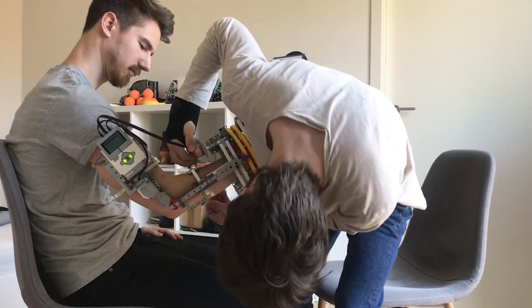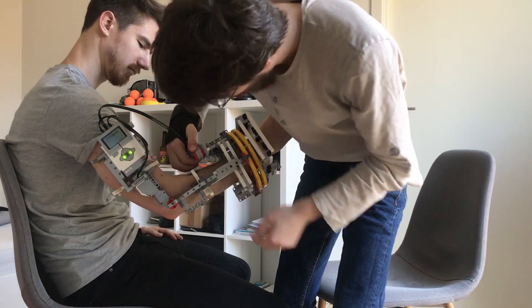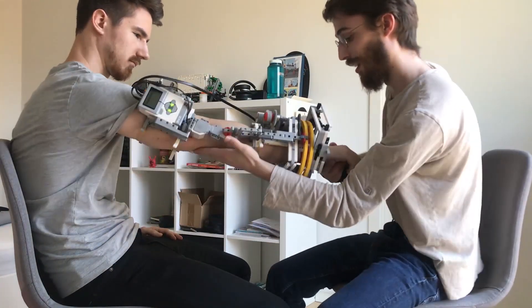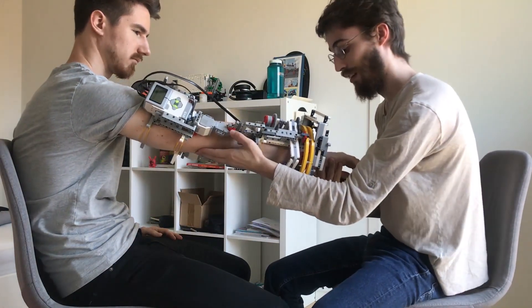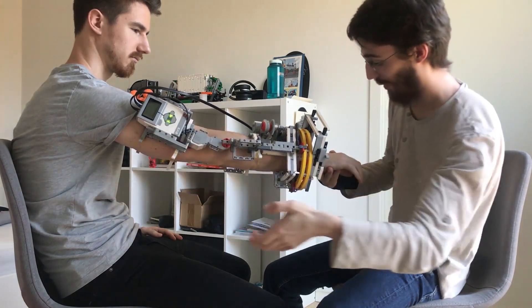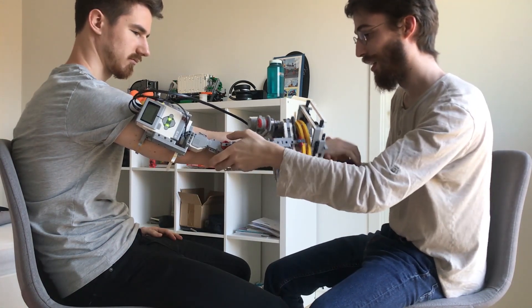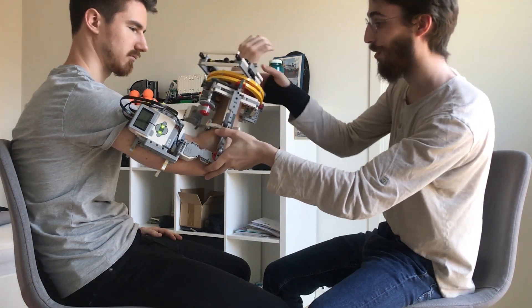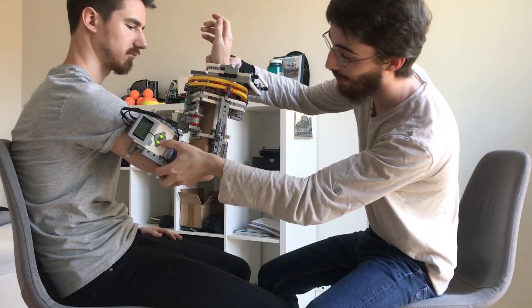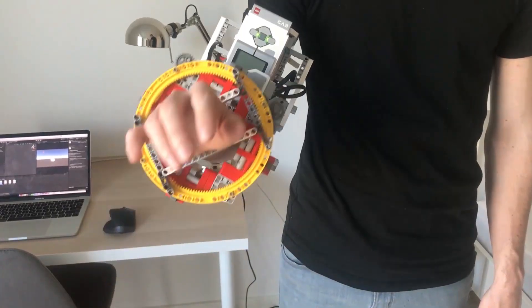Then the exoskeleton is calibrated. The first stage is when the arm is straight, the elbow is not bent and the palm is facing down. A button is pressed to save this posture. The second stage is when the arm is bent and the palm is facing the head. Another button is pressed in order to save this end of the range of movement.